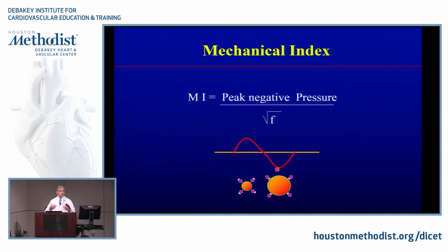So unless you figure out the setting on your machine, I can inject as much contrast as I want and you're going to have quite a bit of destruction. Still, new contrast will come in and I'm going to destroy quite a bit, and it's going to look like a hurricane because it's a mixture of new contrast coming in with destroyed contrast.